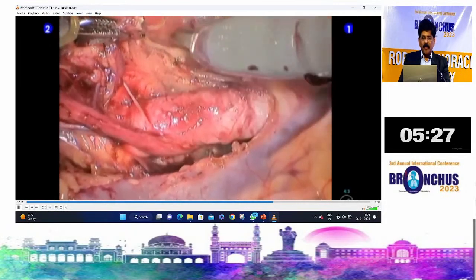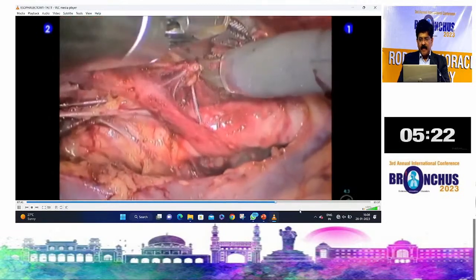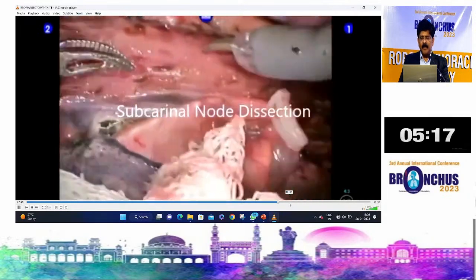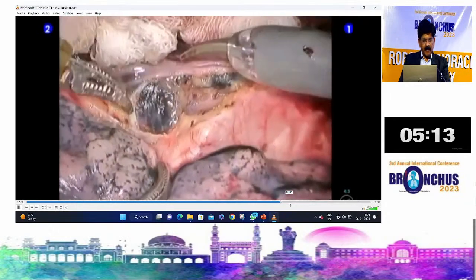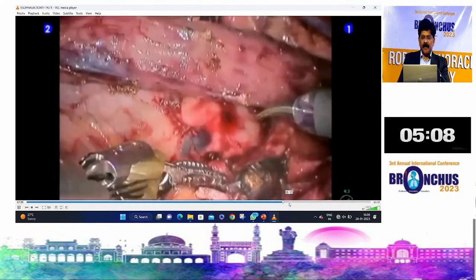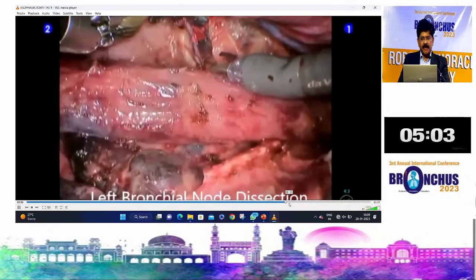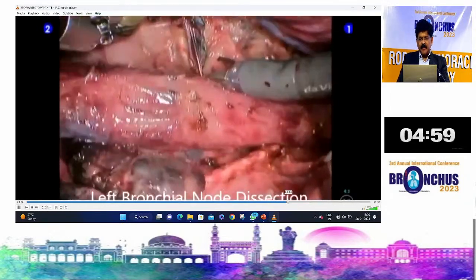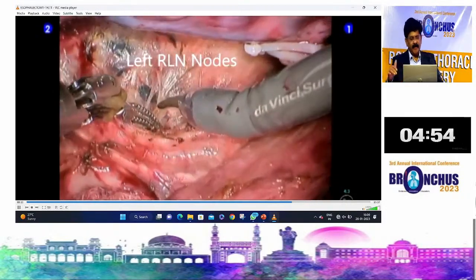And later on, we use a setting of one or two only, and not more than three or four firings, and then remove. And now we have changed this system also. We use saline during the surgery, so that during cautery the saline is flushed over it, so the cautery damage is not there. The second change we have brought is we are using nerve monitoring during robotic esophagectomy. So this has reduced our incidence of RLN complications, and it is a very easy way to do the nodal dissection.